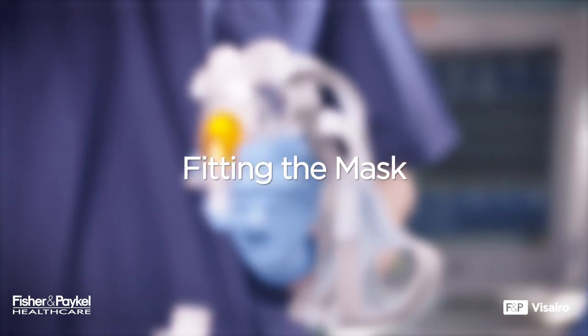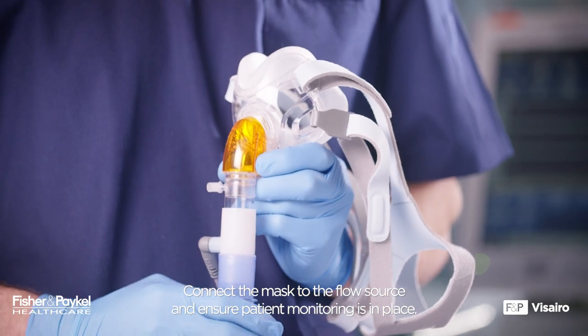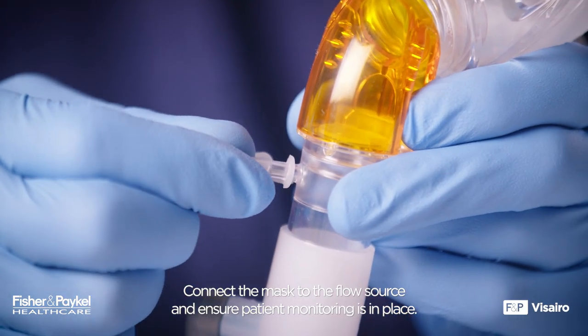Fitting the Mask. Connect the mask to the flow source and ensure patient monitoring is in place.